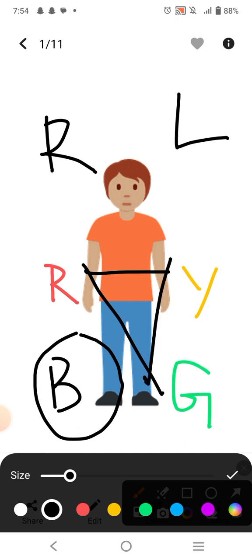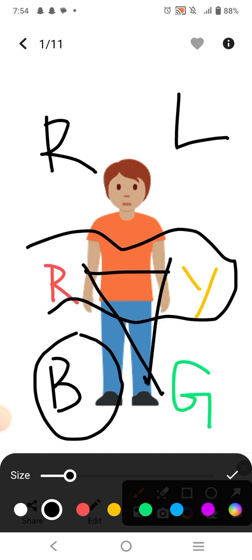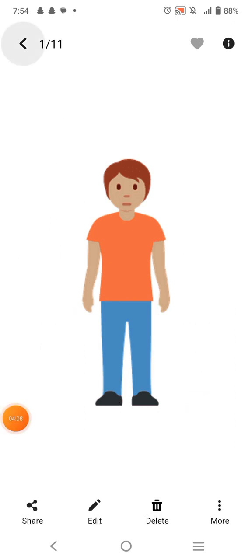In the case of upper limb electrodes, you place the electrodes onto the wrist of the patient or on the styloid process of the ulnar bone. And in the case of lower limb electrodes, these are placed onto the foot of the person proximal to the ankle, somewhere here. I hope this makes sense now.